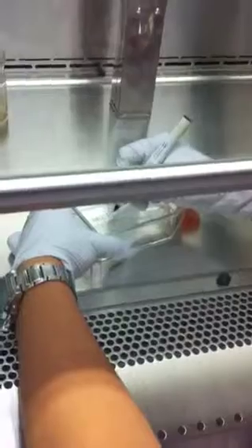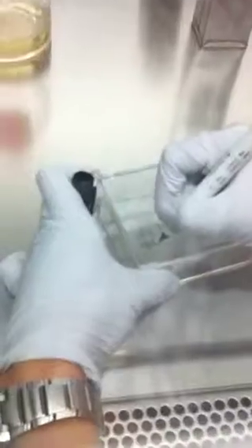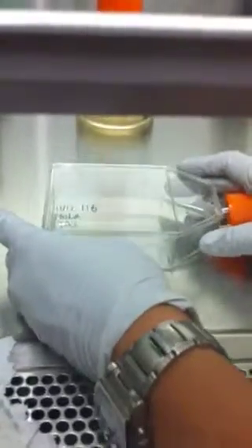So I'm going to do a 1 to 6 or 1 to 5. Yeah, I'll do 1 to 6. Usually it's important to have a split number so you know how full they are. Cell line name is absolutely crucial to keep. My own name on there, so it's my flask instead of other people's. At a very minimum, you should have all this information on your cell line flask. It's really important for your own care. Okay? And now it's a good time to add the media. Yeah, just different sizes, so I'm choosing the size that fits my purpose best.